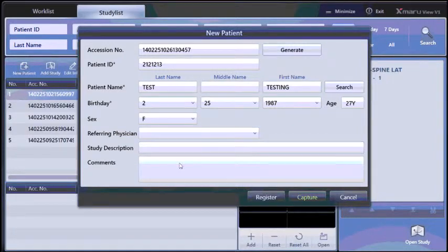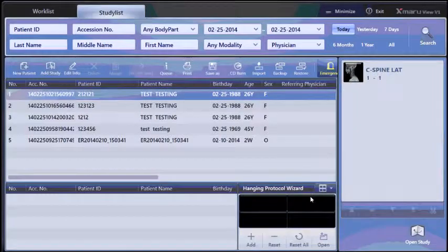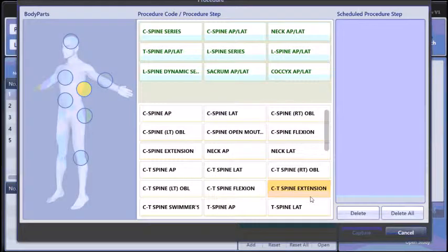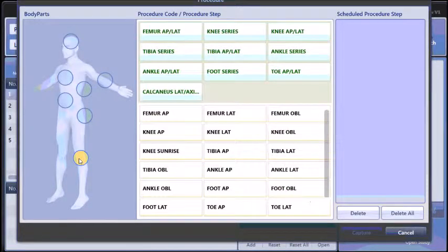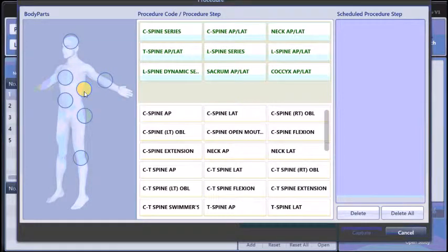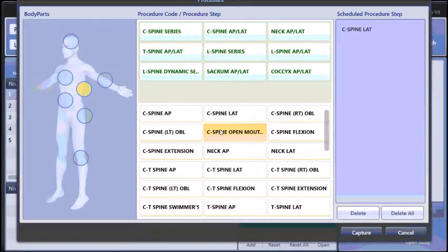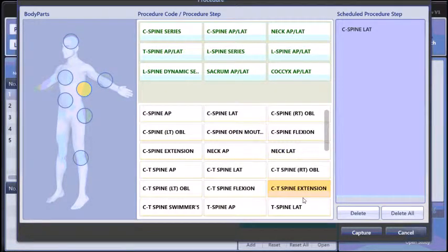Other information is optional and choose capture. At this point, the body region must be selected. Select your views. Multiple views can be chosen and choose capture.